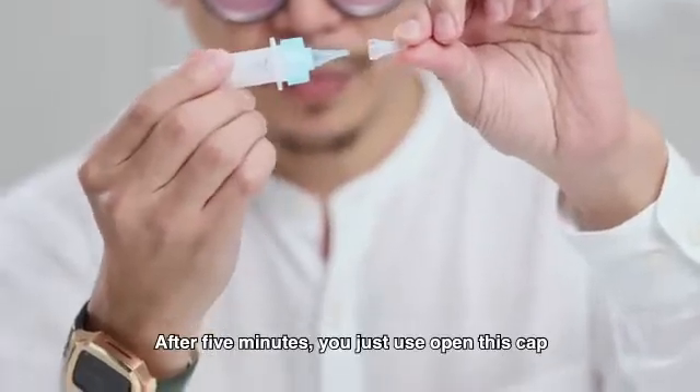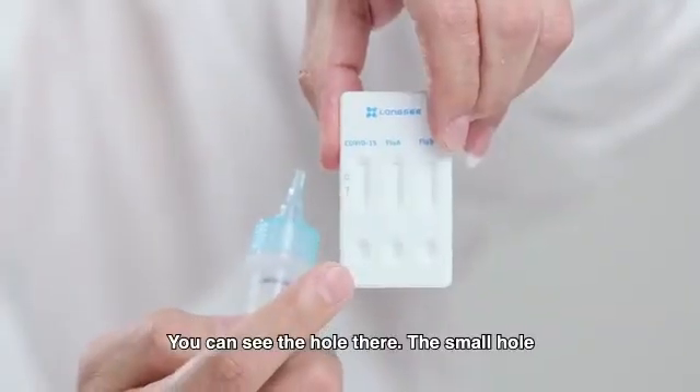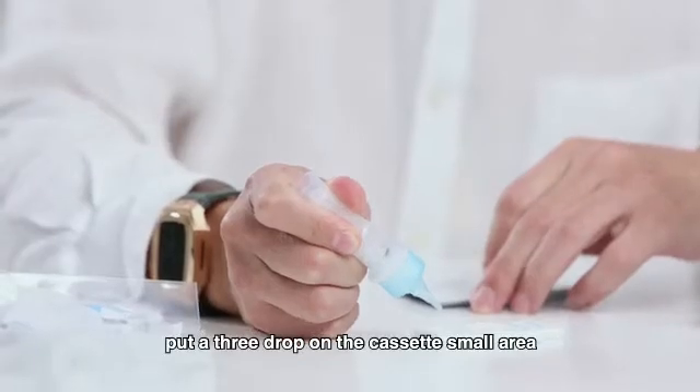After 5 minutes, just open this cap — you can see the small hole there. Put 3 drops on the cassette in the small area. 1, 2, 3.